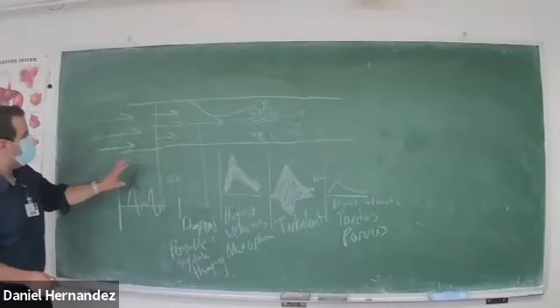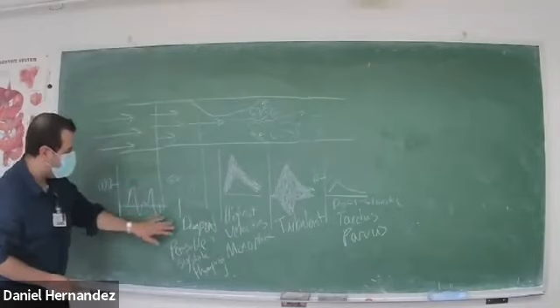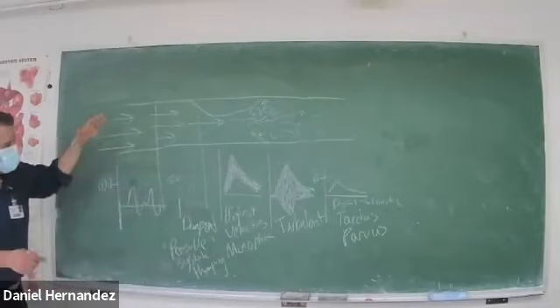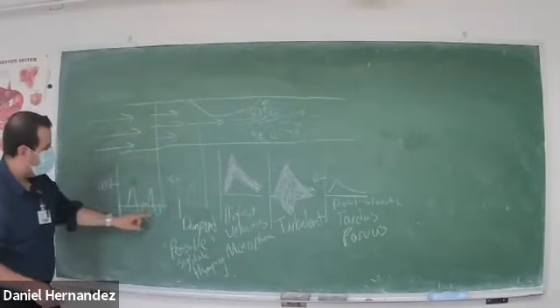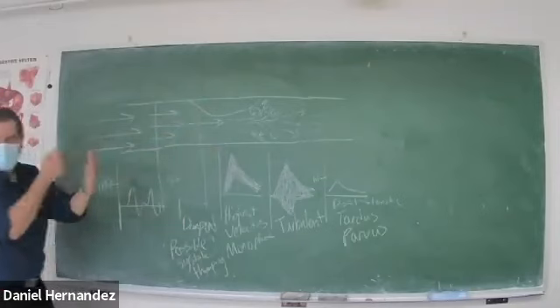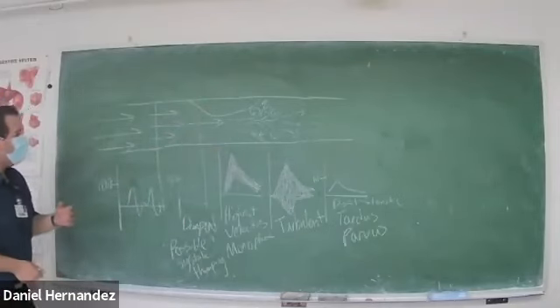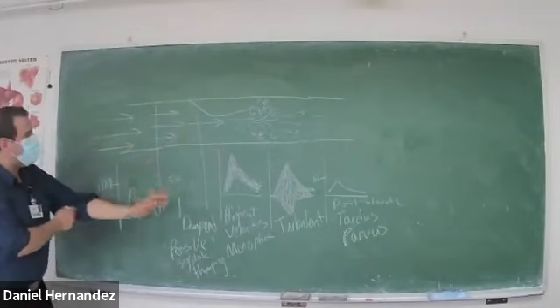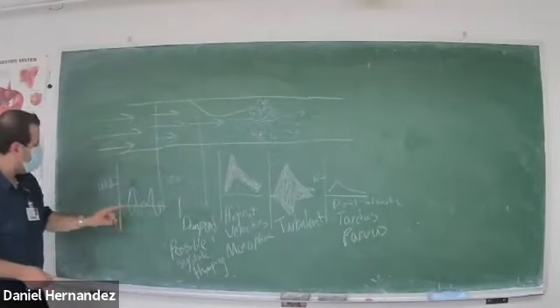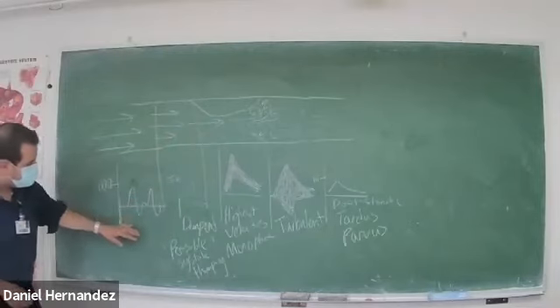So the first thing that you might notice a little bit before a blockage is the waveform starts to become what's called dampened. So the velocities start dropping a little bit. It becomes higher resistance because we now have a blockage in that vessel. So there's more resistance, more force that blood flow is meeting against. But it's further down the stream. So we're not quite at that blockage yet, but we might start noticing some changes. So the waveform becomes dampened. The velocities start dropping a little bit.